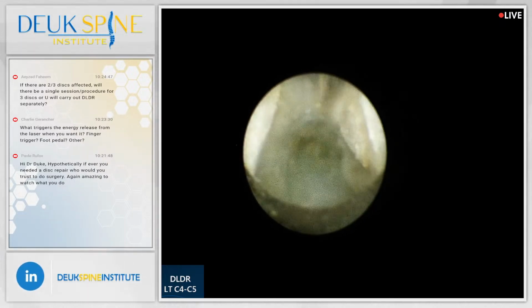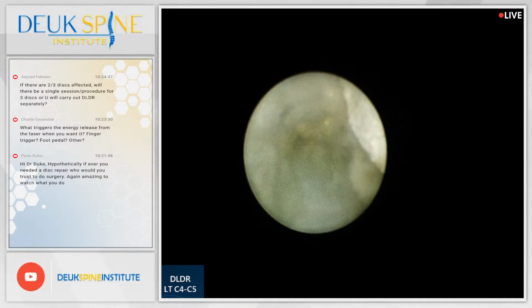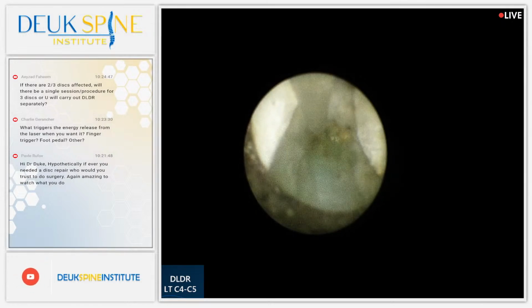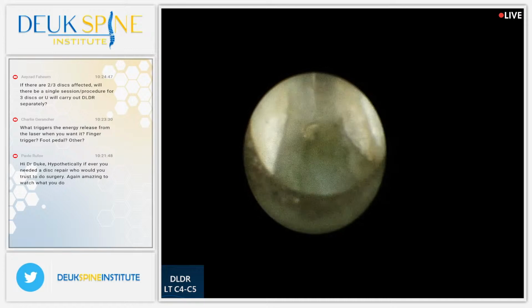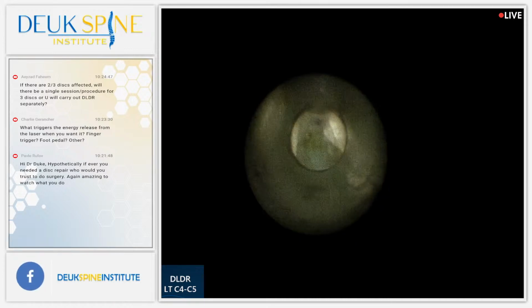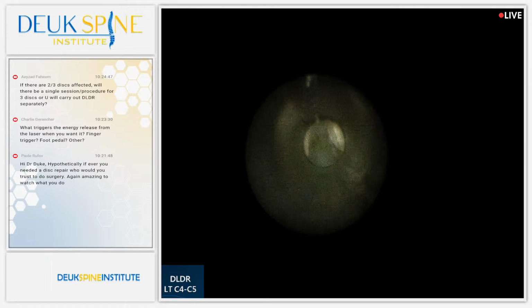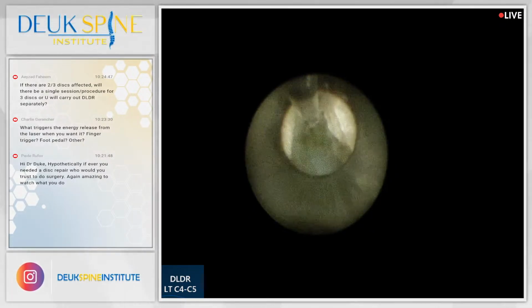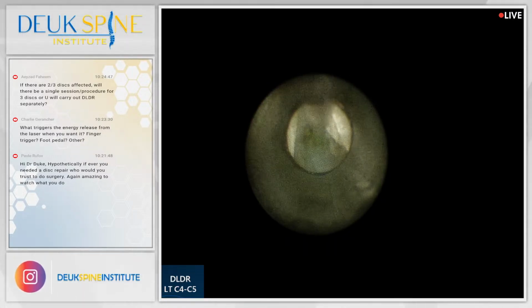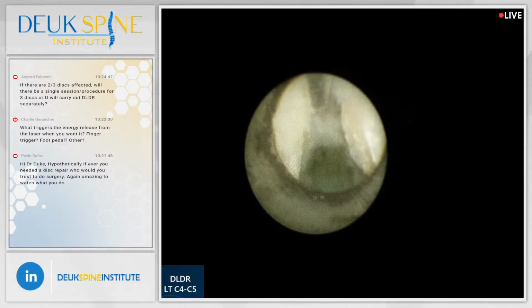Yeah, we're almost done. I thought we were done, but I'm finding that I can get more of this. This is just literally a crazy, crazy herniation. Why is this so crazy? One, it's humongous. Number two, most important, it literally went past. See, all the herniations we typically take out are right here. They're inside the annular tear and just outside the annulus, but they're above the posterior ligament, which is behind the annulus. This one went beyond the posterior ligament.